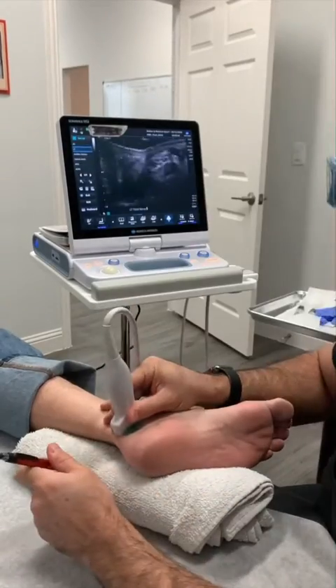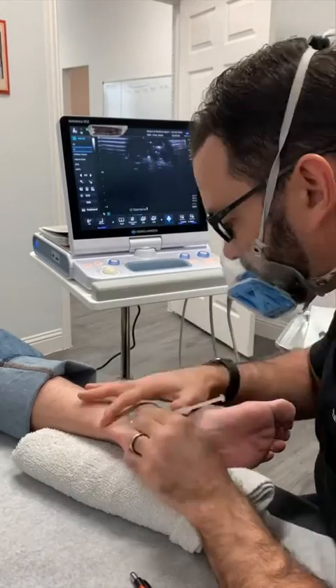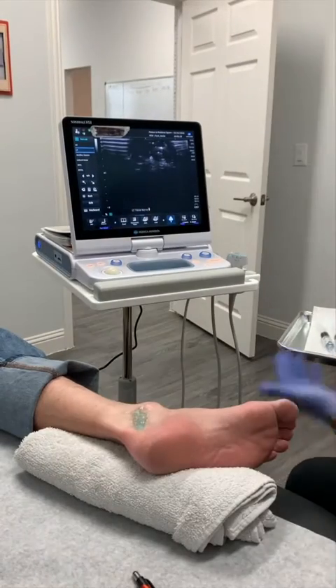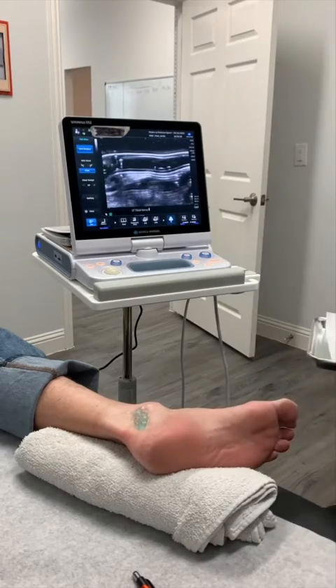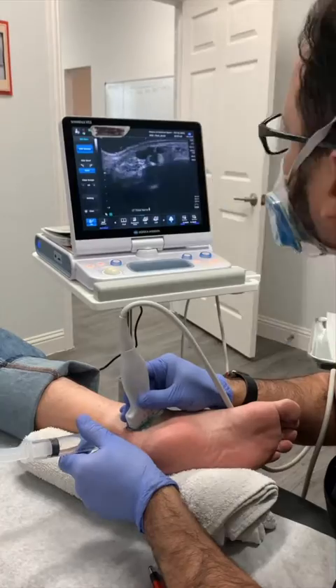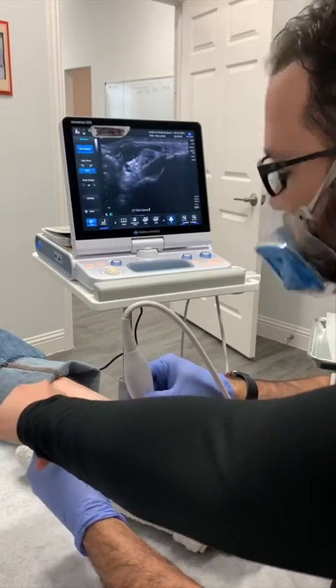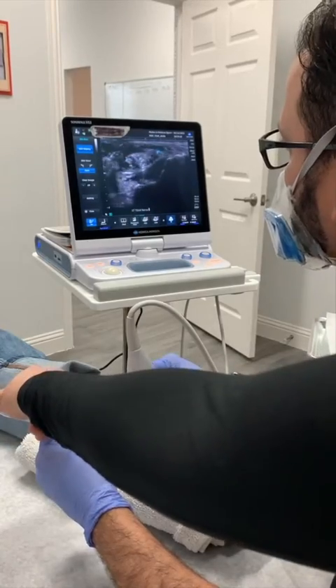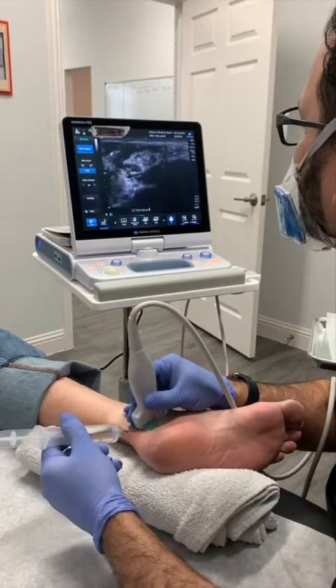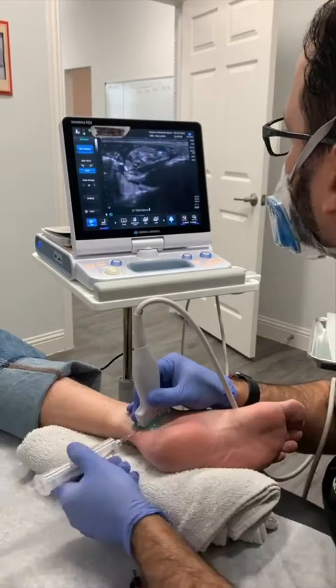First, we find the right spot for the injection using the ultrasound machine. We then clean up and numb up the area to be injected with a wheal of anesthetic so that no pain is felt during the actual procedure. Next is the hydrodissection — we bring the needle adjacent to the structure to be injected, in this case the nerve, and inject fluid from the bottom, top, and side of the nerve to create a halo around it, separating it from any restricting materials that could be impairing its proper function.